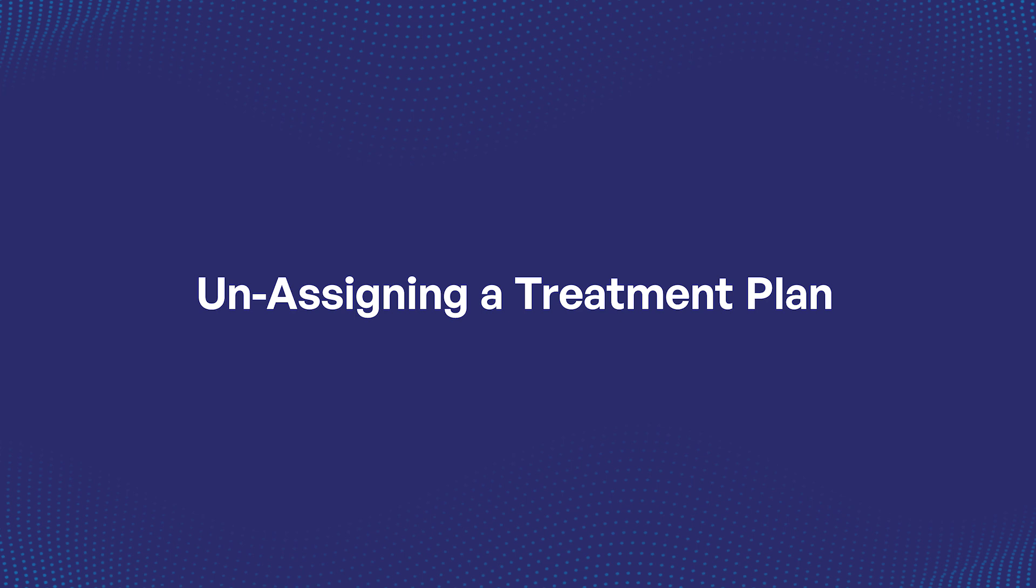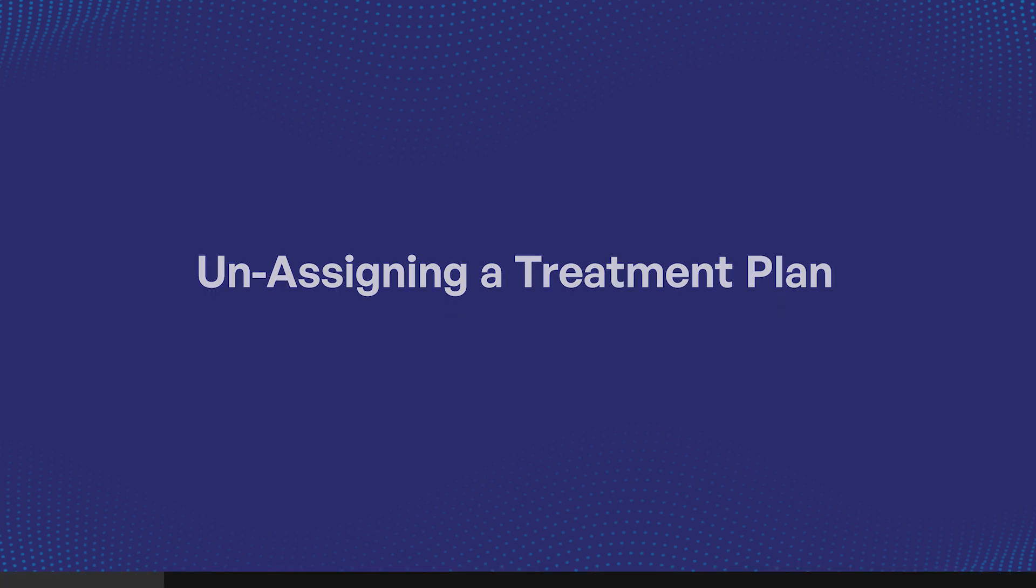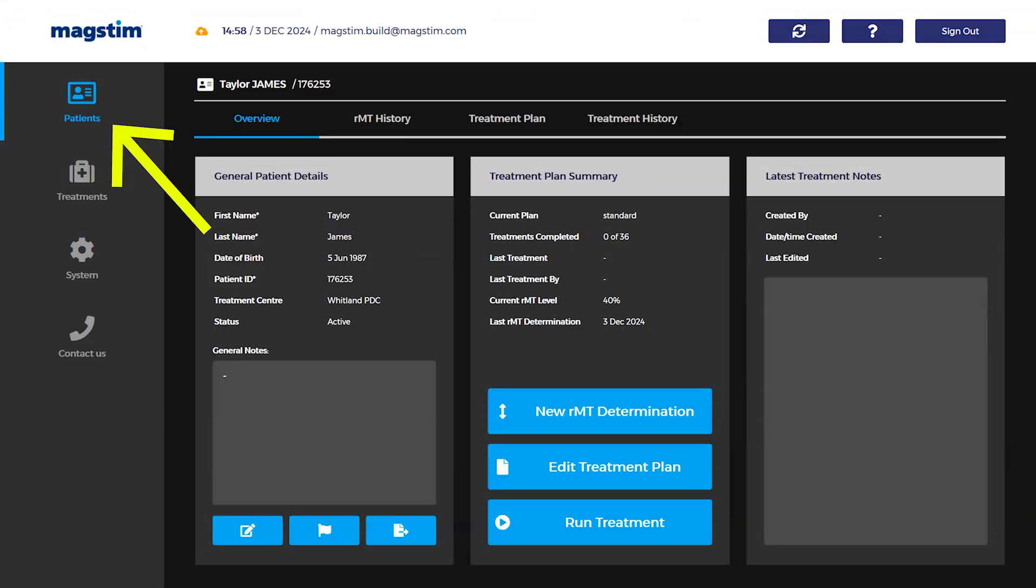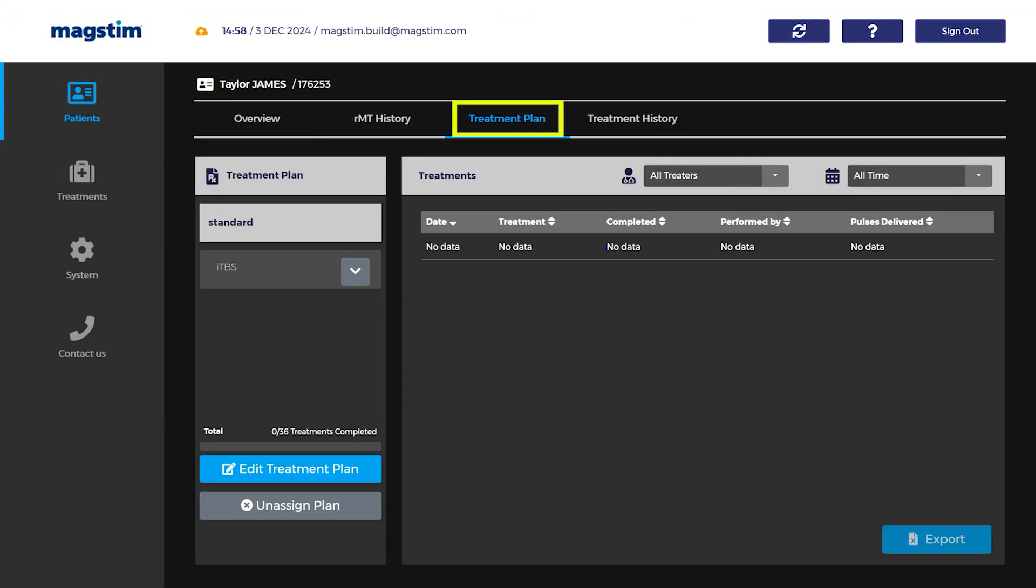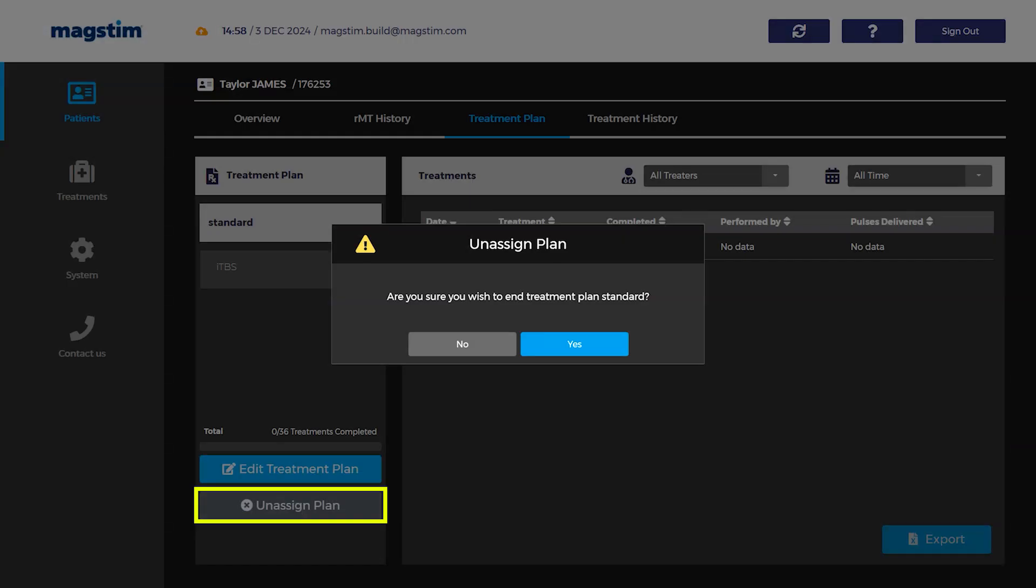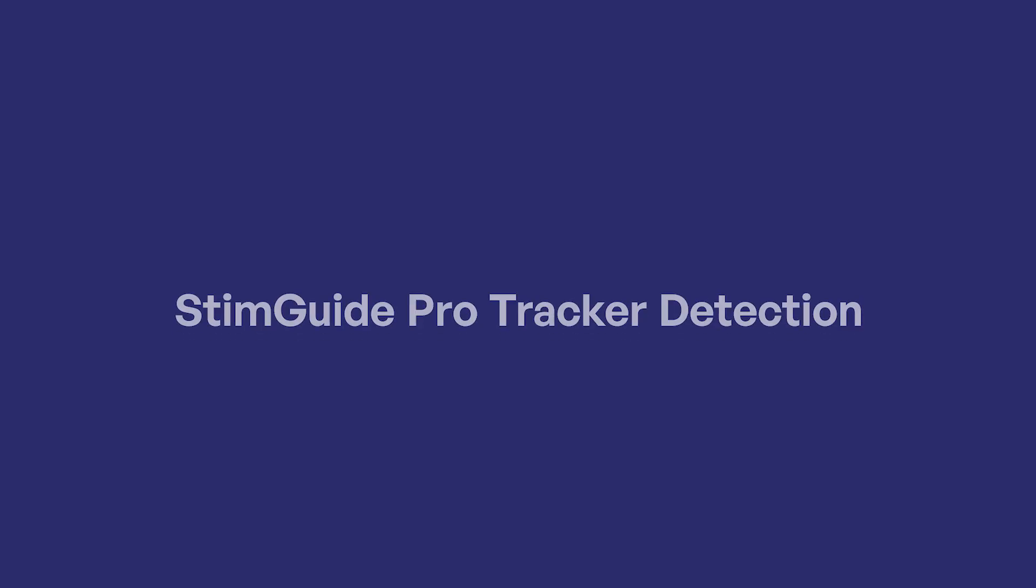Unassigning a treatment plan: On the patient record, select the treatment plan tab. Press unassign plan. The treatment plan, along with any progress, will then be archived.